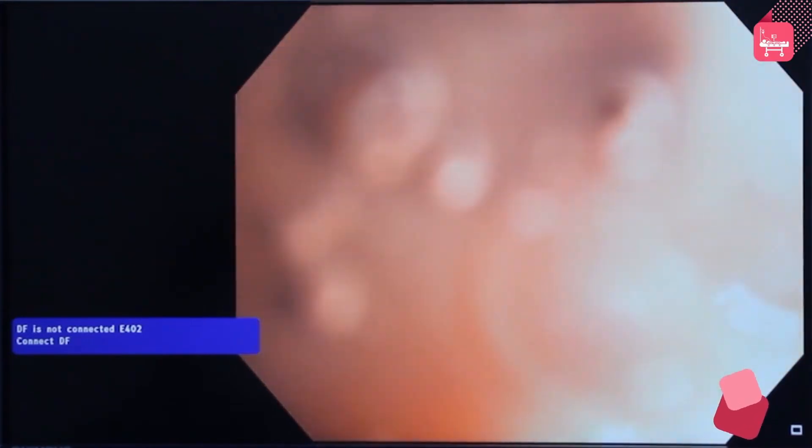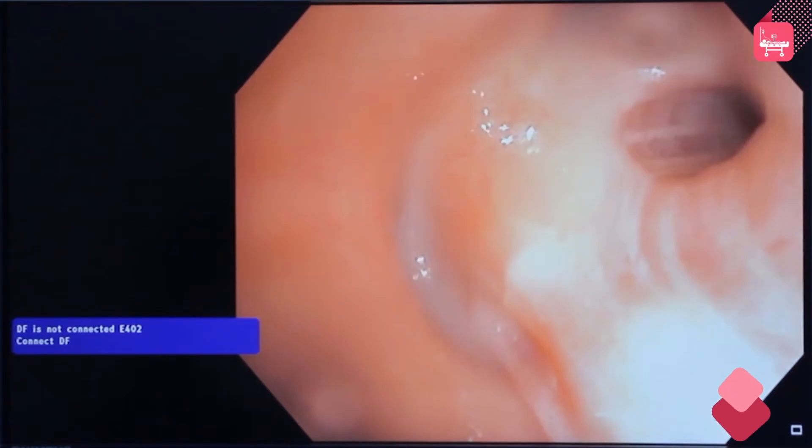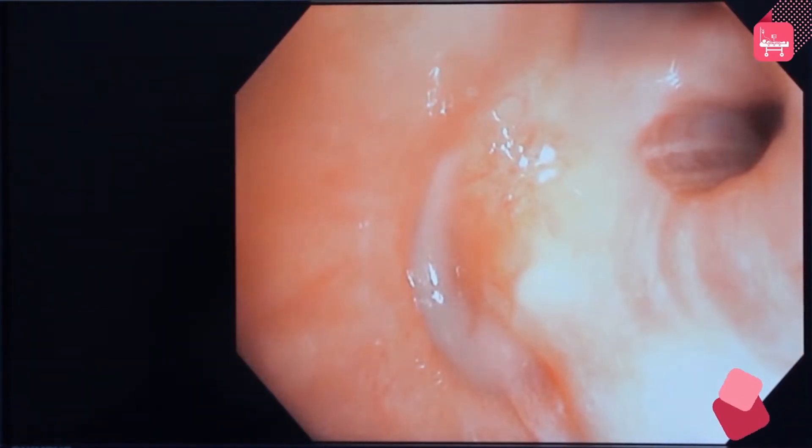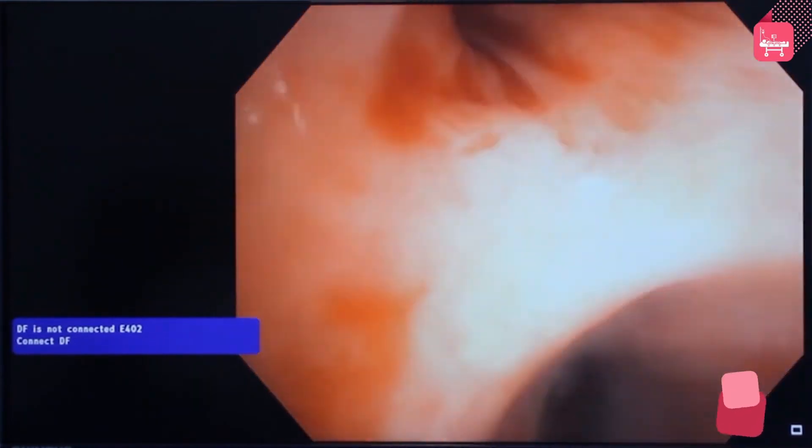Now insert the bronchoscope through the bronchus intermedius. A high amount of mucus secretion is seen in the middle lobe and the lower lobe.